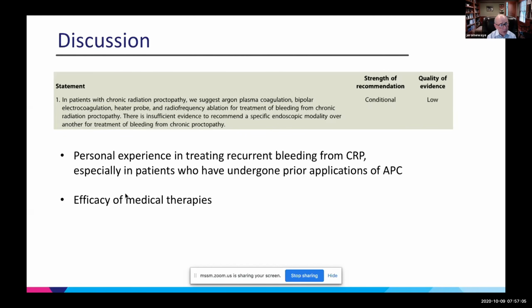I caution one thing: you don't just put formalin in the rectum, because there were some patients that had that, and reports long ago that you can shrivel up the rectum by putting formalin in. What the surgeons do is they put 10% or even 1% formalin on gauze strips, and through a proctoscope lay the gauze strips on the mucosa and leave it there for 10 minutes. So you don't just put formalin in the rectum and expect it to work.